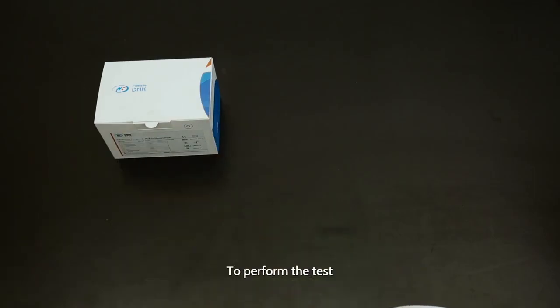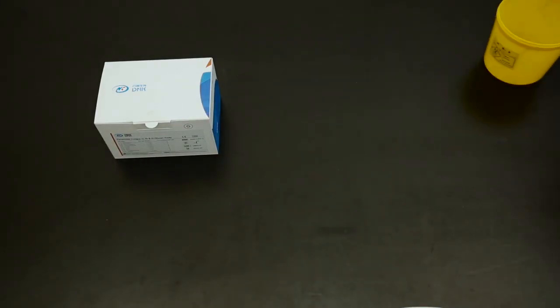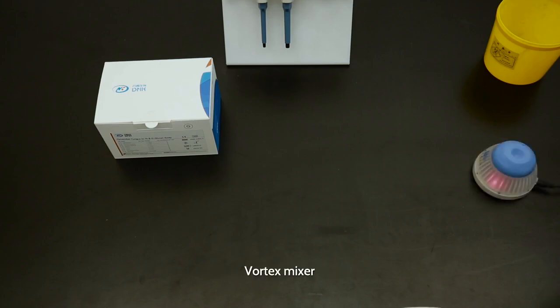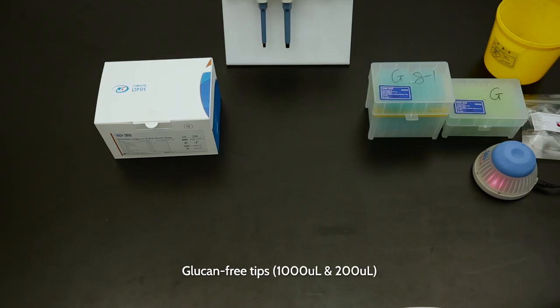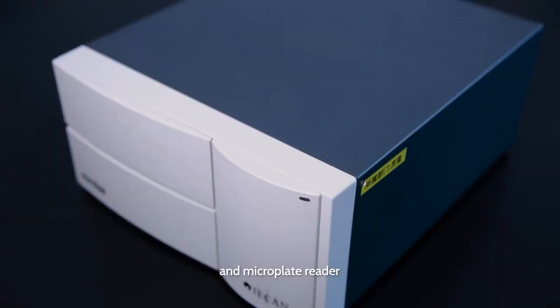To perform the test, ensure that you have all the consumables and instruments: pipettes 1000 microliter and 200 microliter, vortex mixer, glucan-free transfer tubes, glucan-free tips 1000 microliter and 200 microliter, tube rack, timer, and microplate reader.